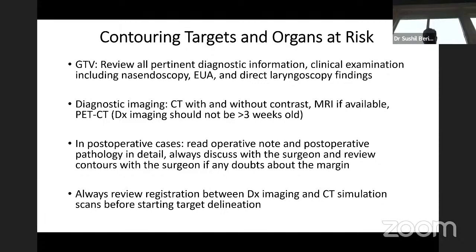laryngoscopy, and imaging. Now, when you use PET-CT, it is very important to understand that the windowing of PET-CT is very important. You could make a GTV look bigger or larger depending on how you window your PET-CT. People have done studies looking at PET-CT windowing at the level of liver, 40% of maximum, 50% of maximum, defining by SUV maximum or threshold. Out of which the worst way to define GTV is a threshold SUV. If you use some arbitrary threshold of SUV of 3 and above, the GTV tends to be very large.